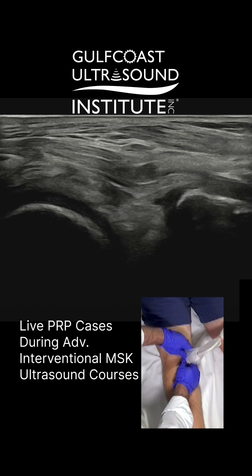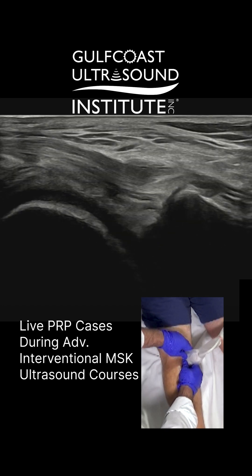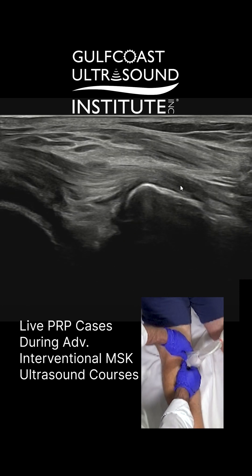I'm trying to get the semimembranosus into view here. So that's that hyperechoic fibrillar structure. The semimembranosus is attached on the posterior tibia, not on the PES. So there's the semimembranosus.